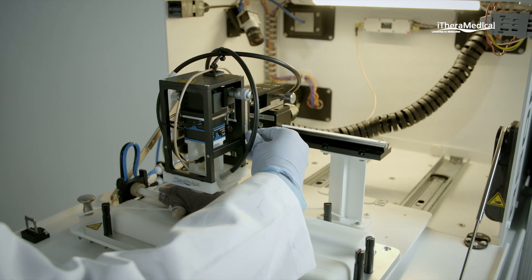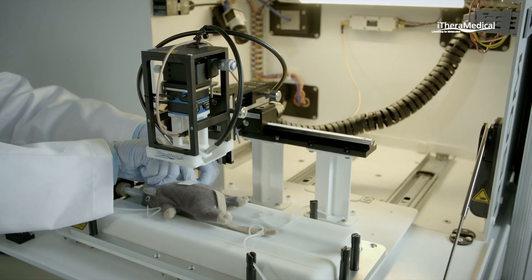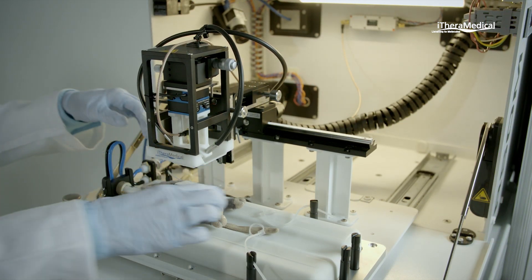After completing image acquisition, the scan head and cuffs are released, anesthesia is switched off, and the animal is returned to its cage.